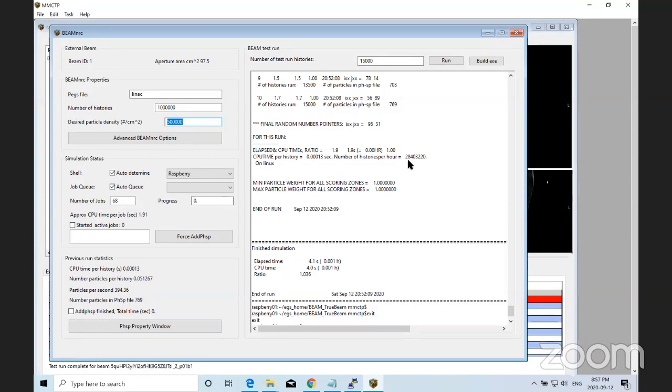One option you have is a close connection option. What that does is, if you've launched a simulation and it is hung on the dose XYZ side or the BEAMnrc side, there's an option to close the connection between the two programs. That will force a termination point, and then you can resubmit the simulation after that. I don't know if that answers the question though.